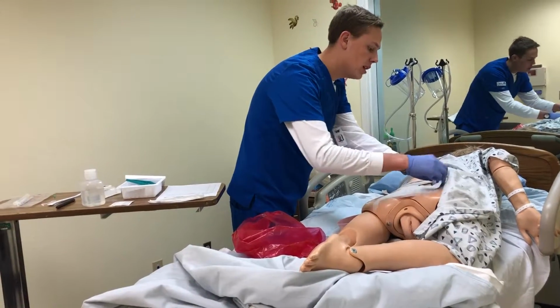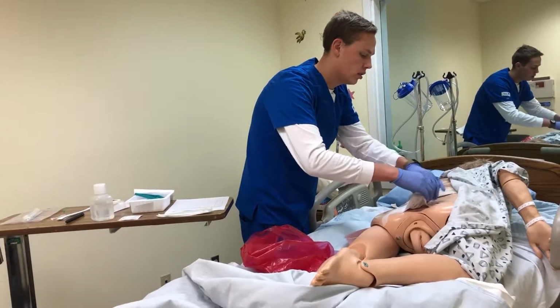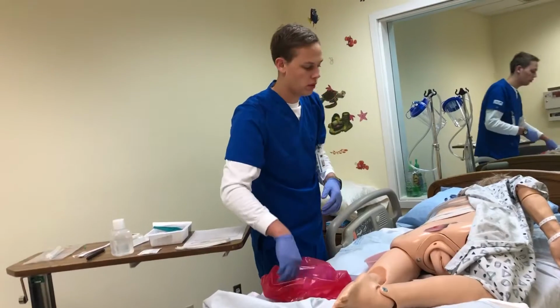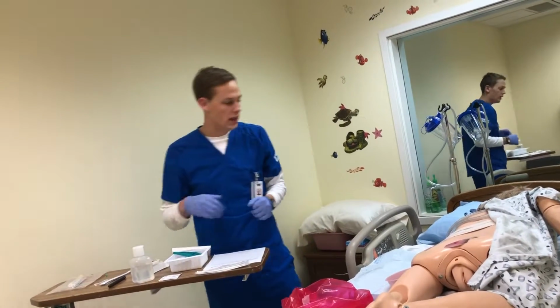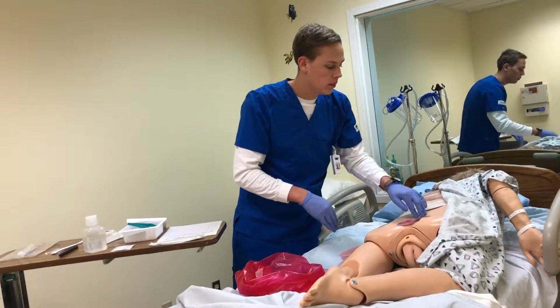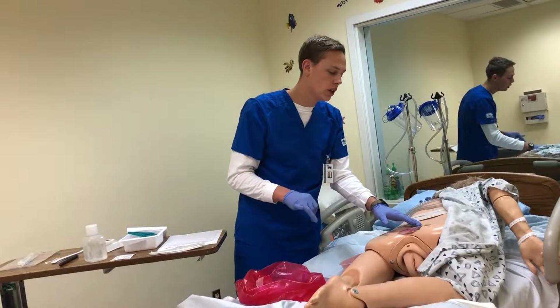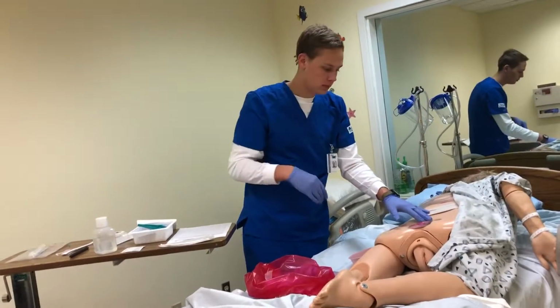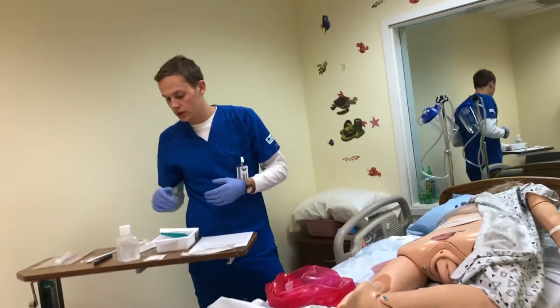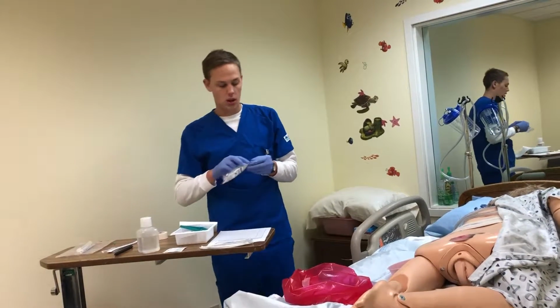And if the tape is having trouble coming off, I can use an adhesive remover to help. I'm just gonna roll it off. Okay, and then place that in there. Get new gloves on, and then just assess the pressure wound. I'd push in and palpate around it for any tenderness. I would note any color, the odor, any slough or eschar that's there. And then once I'm finished with that, I can get on new gloves and get ready to do my irrigation.